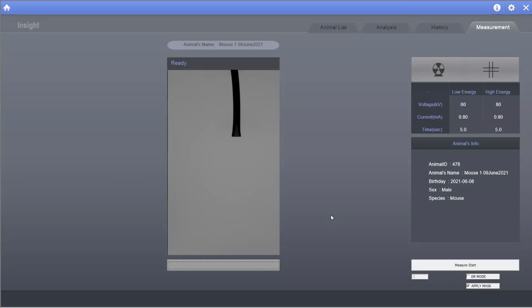Okay, so we're knocking down the animal. And again, once that's in place, we will turn on our vaporizer going to the system and move the animal over once he's comfortably asleep.